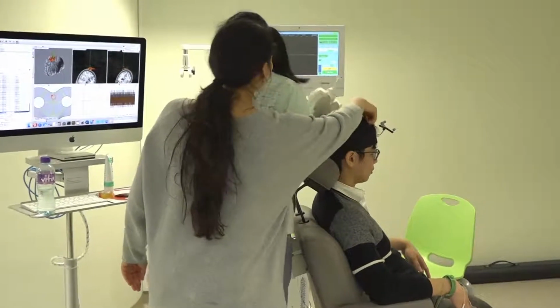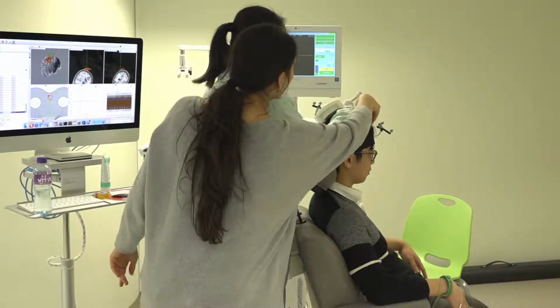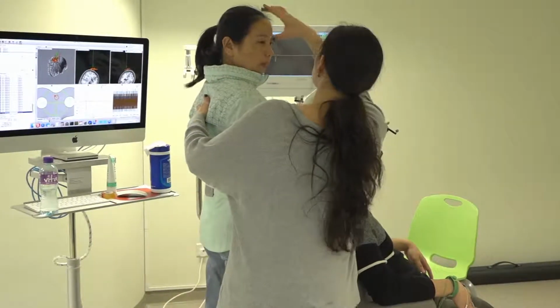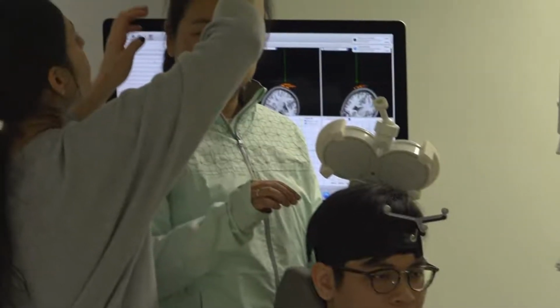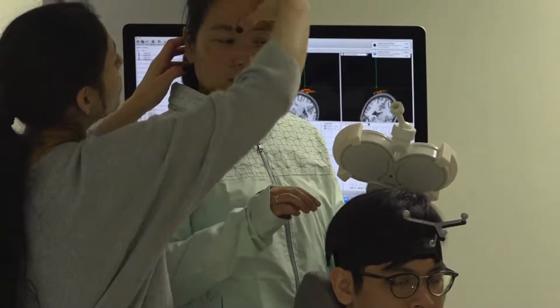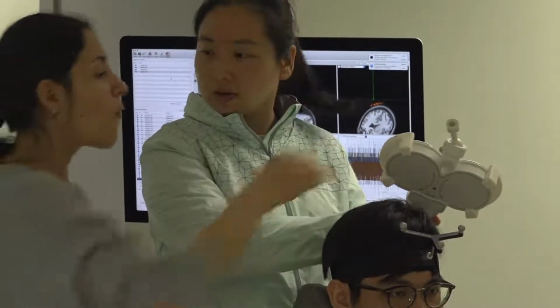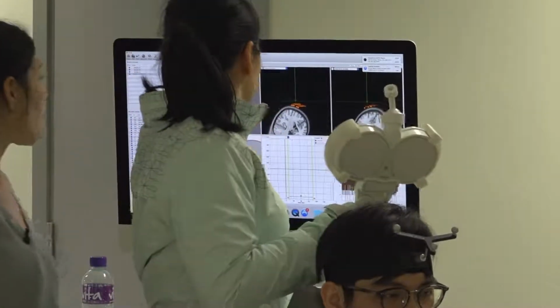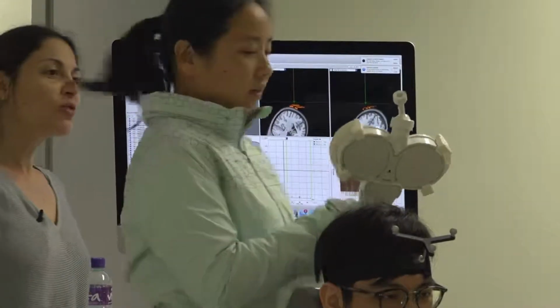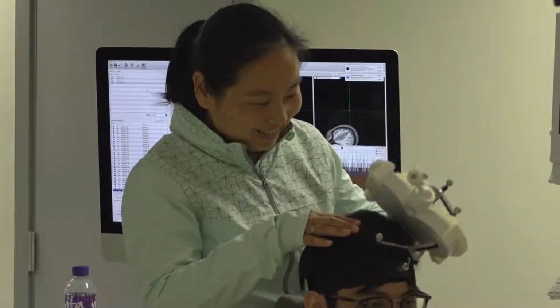So try, well, you have this. You can try to find it on yourself. As I said, this is your inion. And then you go to the center. And then go one third. It will be somewhere like, you see? Okay, so it's in this area. It's in this quadrant. So if you already have that point, it's the spot. But try yourself. Don't cheat.